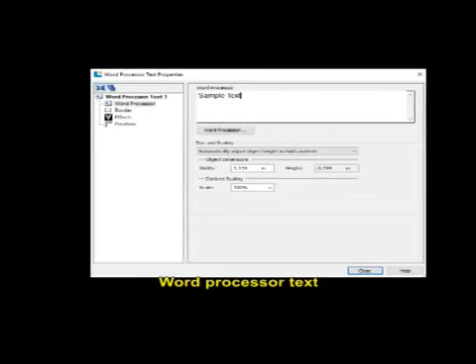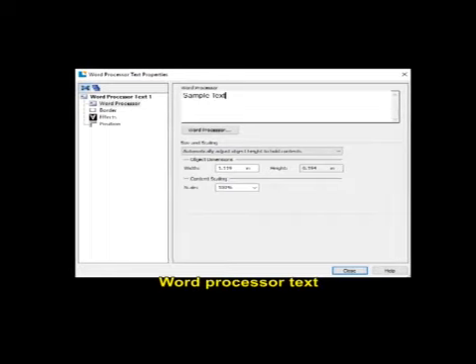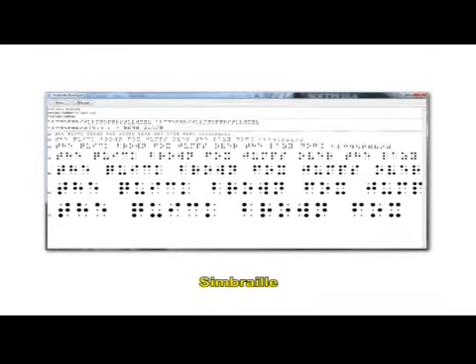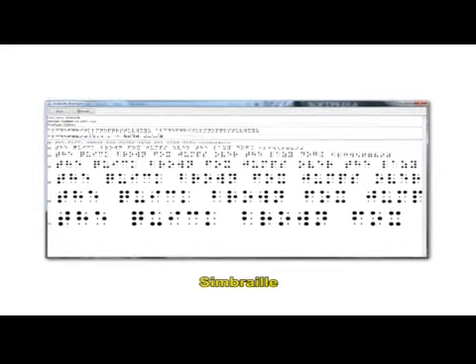The work displayed on a computer screen is simulated Braille, or sim Braille, which is a visual representation of embossed Braille. Sim Braille comprises lines consisting of cells that contain combinations of the 6 dots representing letters, numbers, and punctuation. This display allows sighted transcribers to preview the Braille before it is embossed onto paper. Transcribers proofread and format the translation, then they issue a command that will send the file to the Braille embosser in order to have a printed version of the Braille text.